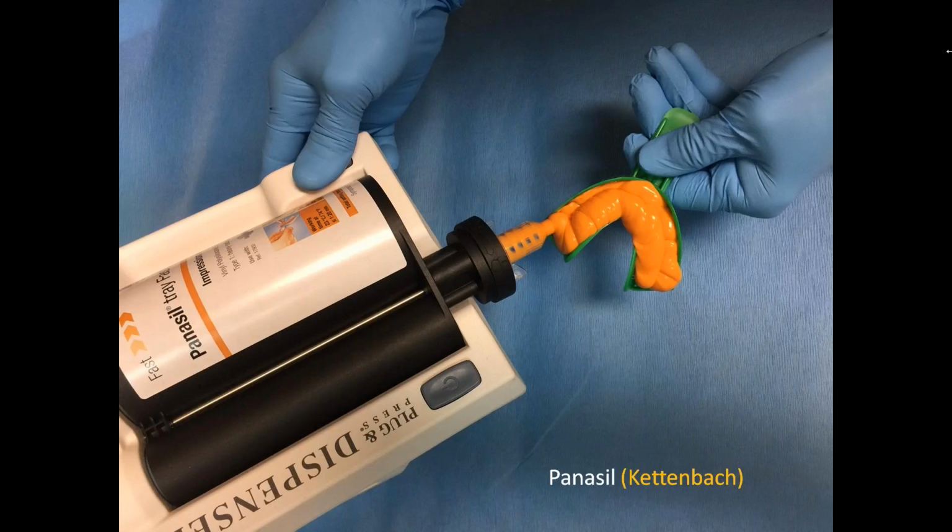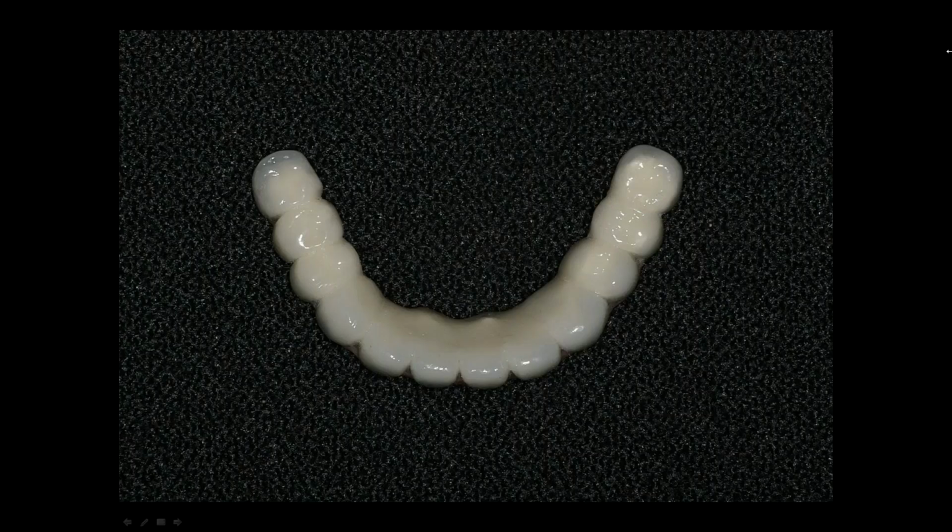Delivery is much faster. We're allowing the upper area to heal at the bone table. So at 4 to 5 months, we went ahead, removed the healing caps from the engaged implants and tested, and we clearly had a very high number. So at that point, we knew we could go ahead with restorations on top and bottom now. Here's the occlusal view of the maxilla and the patient's final cosmetic and functional result.